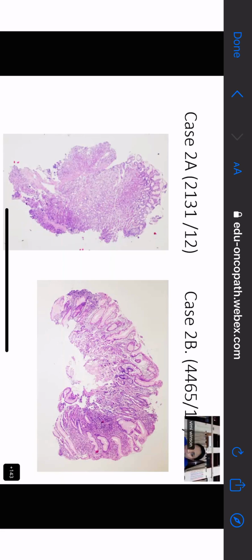Right. So Dia is right that this is gastric body mucosa. Shweta also said that, but Shweta didn't know why she was calling it gastric body mucosa. Body and fundus, there's nothing to choose from. They look the same. This is gastric body mucosa, which is what you also see in the fundus. You have very short foveolae and the length of the glands is very long.